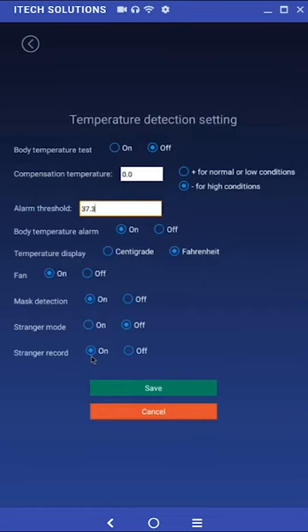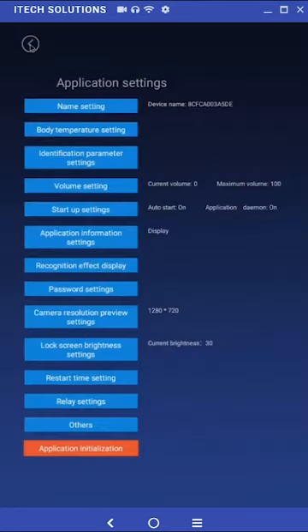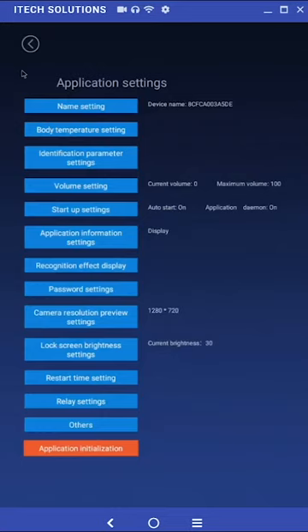Enabling stranger record will record the check-in time, temperature, and picture taken of the stranger upon check-in. Their information will be saved under pass record. Once the desired settings are changed, click on save to apply changes. If you wish to change something later, you can always go back and make the appropriate adjustments.